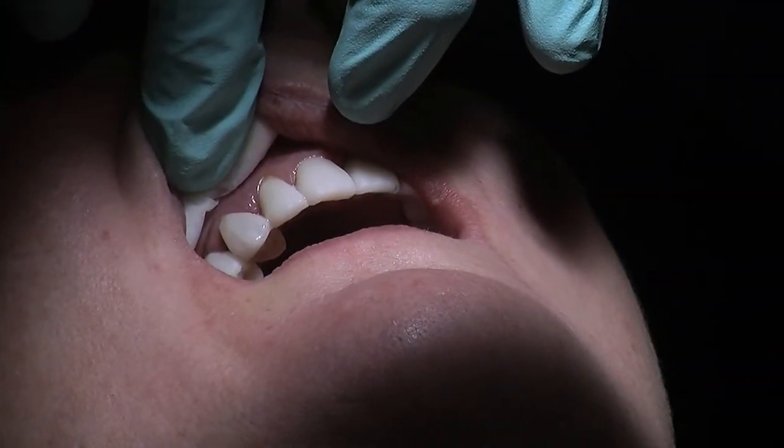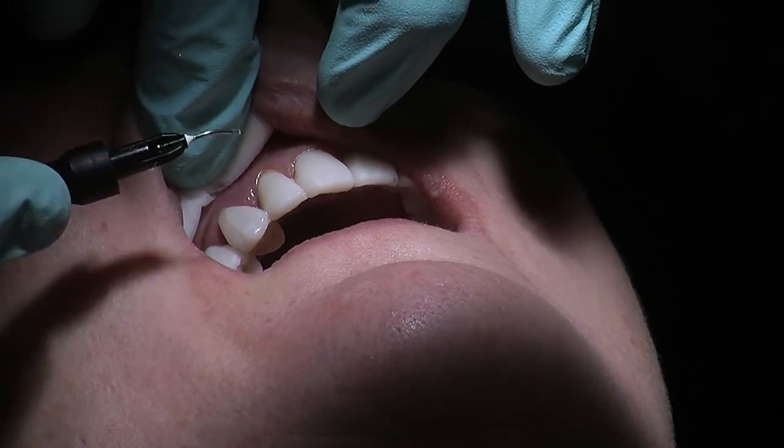Just put that light on there for about 10-15 seconds. You don't need any etch or bonding or anything. From my experience, it just sticks to the material and that's it. You don't have any problems of the material coming off, which is also a big advantage. Take it out. Just want to add one other little bit here.